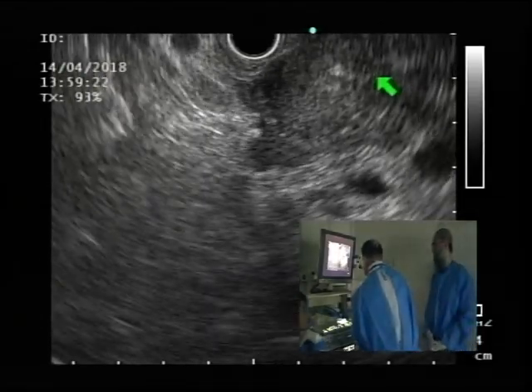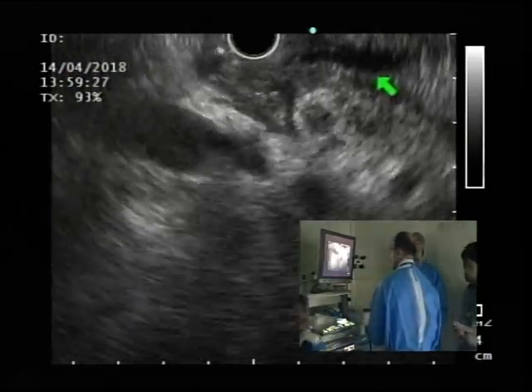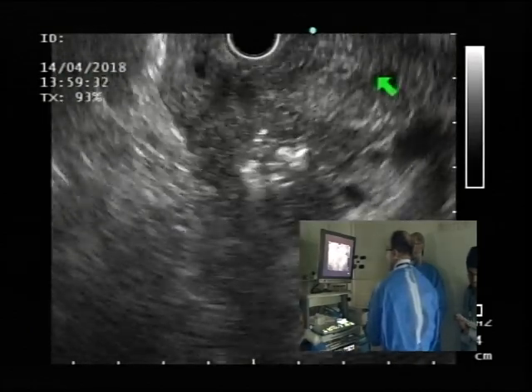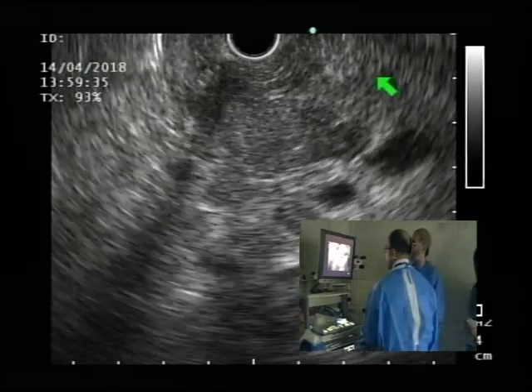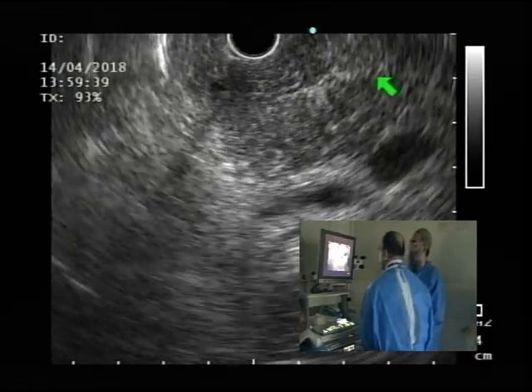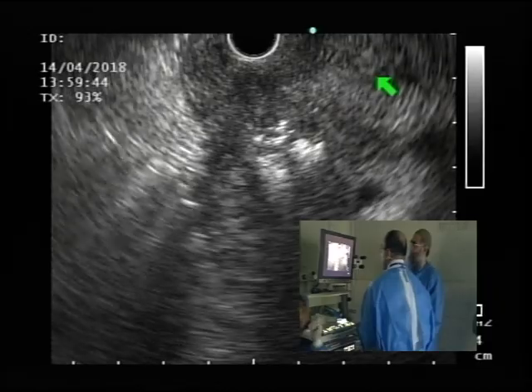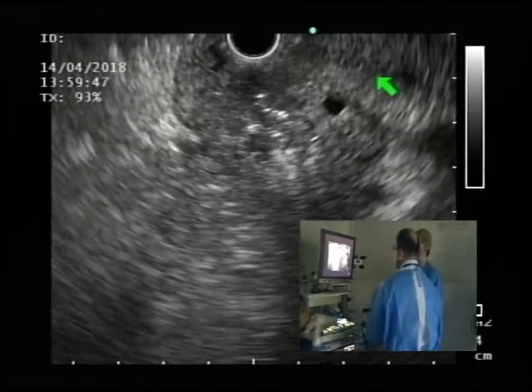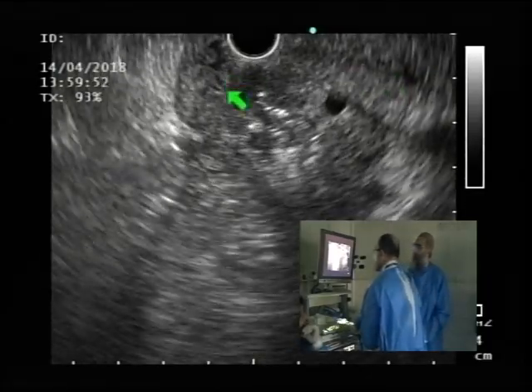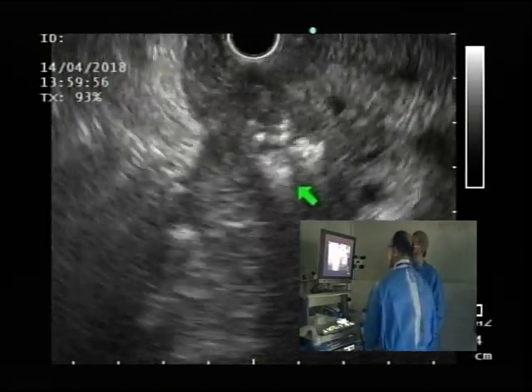And the longer we wait, we can continue to evaluate. So basically, again, this is your lesion. It's hypoechoic compared to the rest of the pancreas. It's possible that it's necrotic tissue. I don't know if it's like, because the duodenal lumen is on this side, so maybe that, or it's part of the duodenal lumen. It's hard for me to tell with certainty.